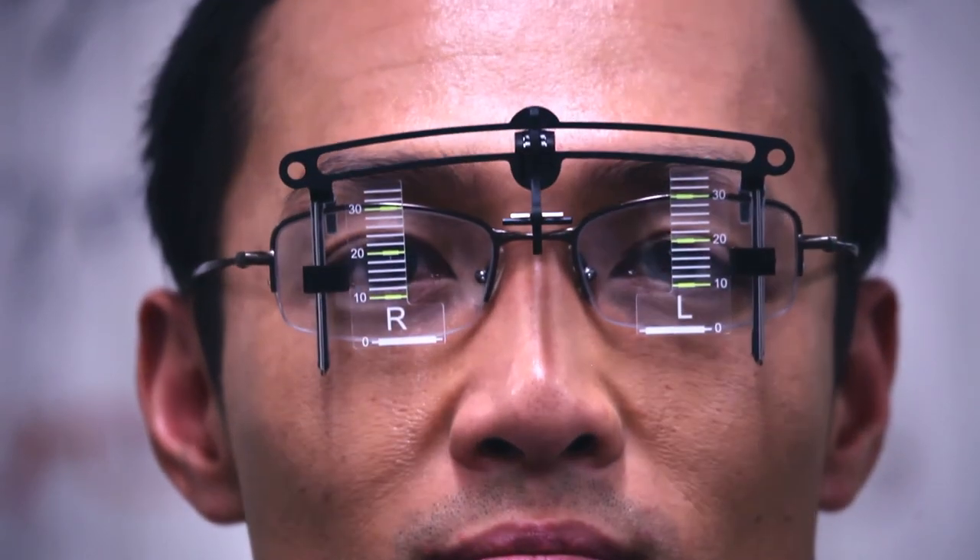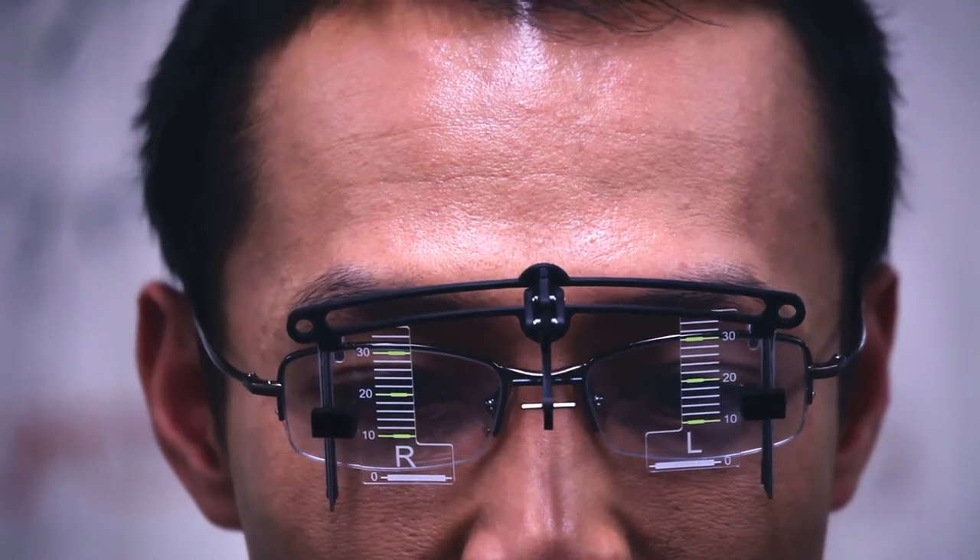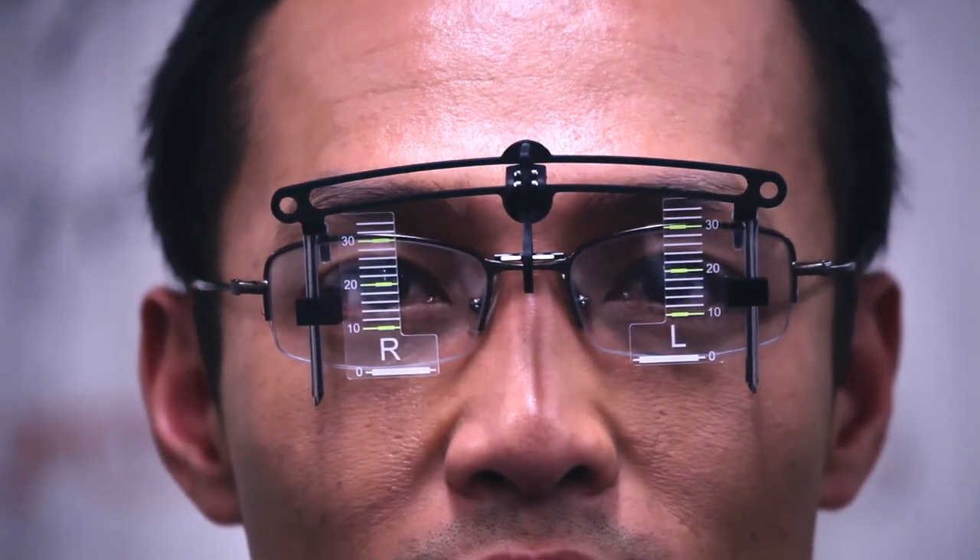Once the pins are visually aligned, it shows the dispenser is viewing at a line of sight with no parallax error. The dispenser then looks across to the grid to see where the pupils are dissecting.